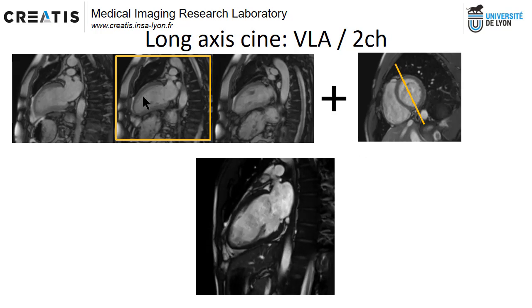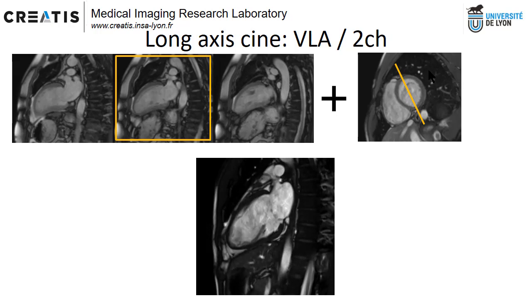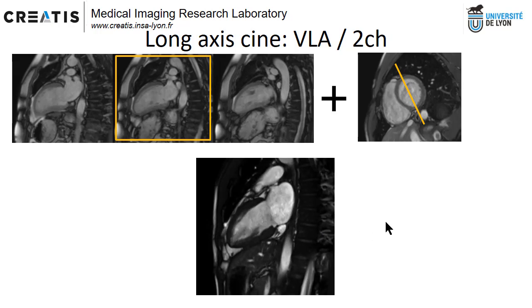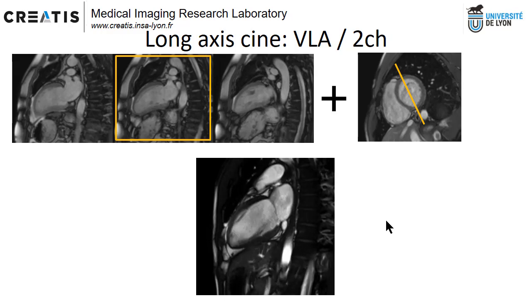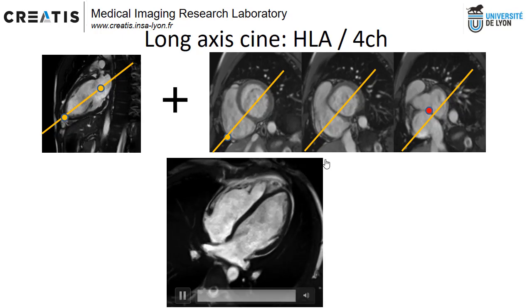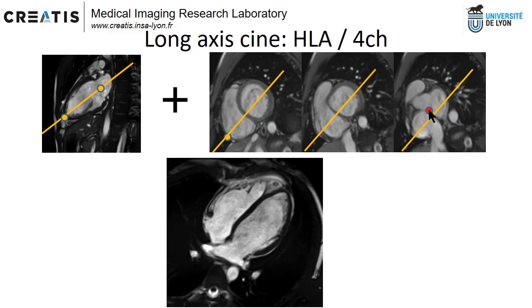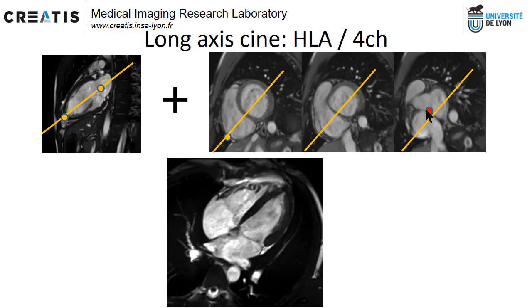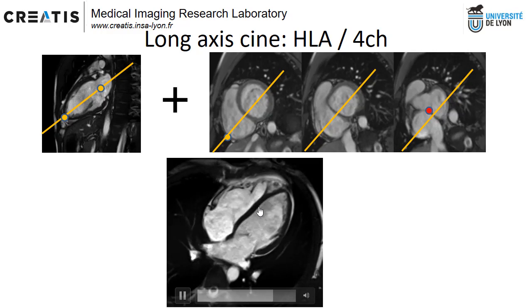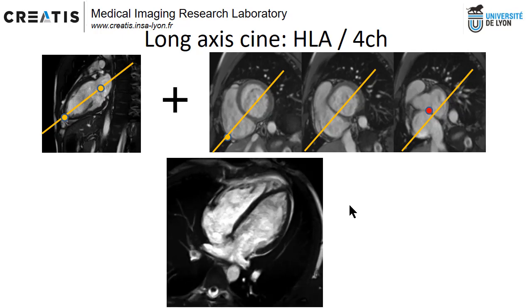Then you copy this plane and adjust it out of the short axis view to cover the anterior wall and the inferior wall, and you get this nice vertical longitudinal view of the heart — the two-chamber view. Then you make it below the lower point of the aortic root to actually cover the septum, the interventricular septum and the anterior atrial septum, and you get the four-chamber view.